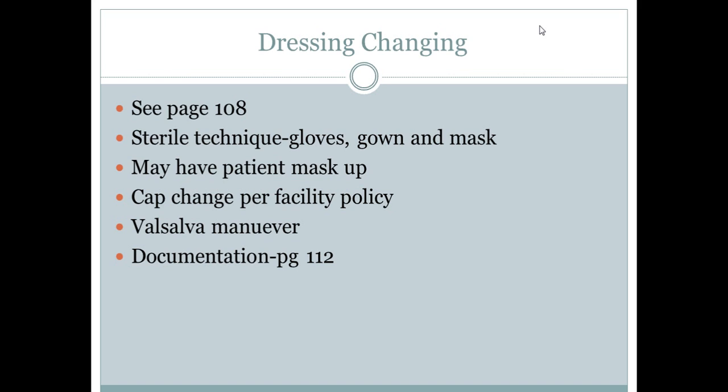While we're doing this, especially when we're doing a cap change, the caps are at the end of the lumens, and that's what we're going to use, like the Luer-lock to screw on IV tubing, or we're just going to leave the caps on. Those are going to cover the lumen, because normally then they're just open.